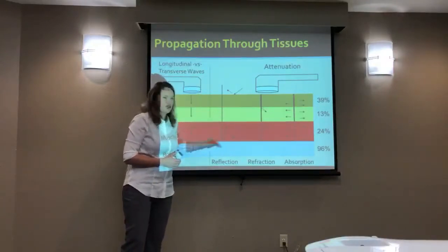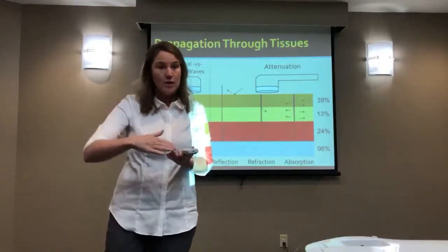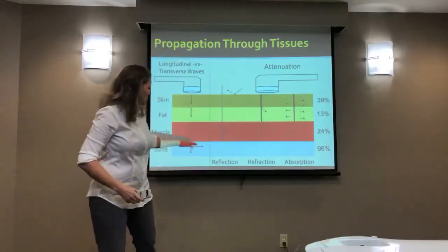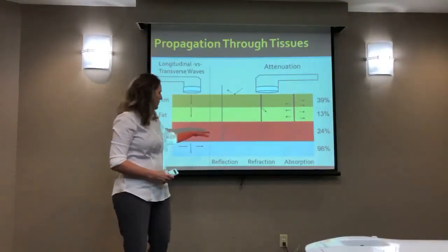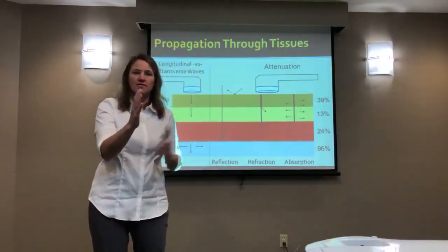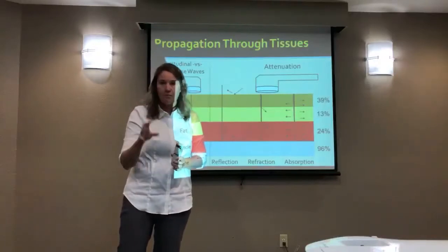The second most common place is at the level of the soft tissue bony interface. So when your soft tissue meets the bone, you go from your soft tissue, which has a density more like a liquid, and then you get to a bone, which is a solid. Whatever energy's left, a lot of it will reflect back off in the other direction. So this can actually make just above the bone a really good target, because your energy's coming in, it reflects off and meets incoming. So the new incoming waves meet the reflected waves, they combine right there, and right at that periosteal and just superficial to the bone, that area is going to get more energy accumulating.